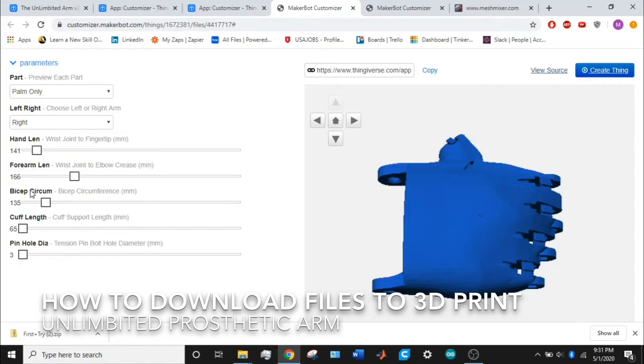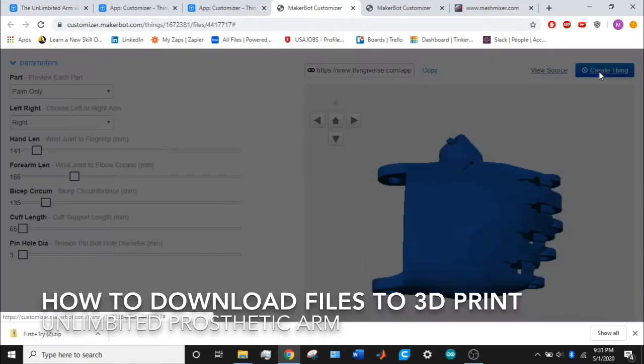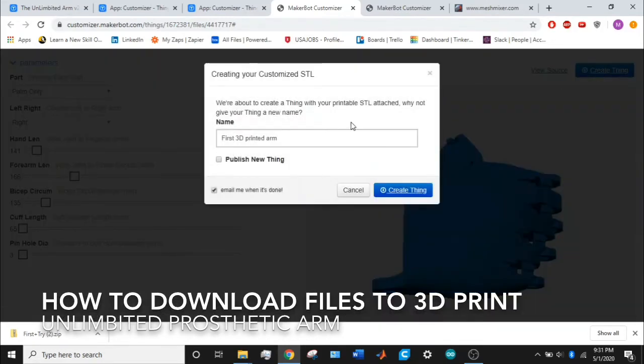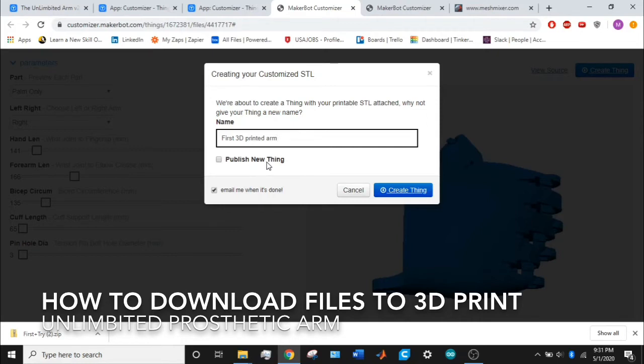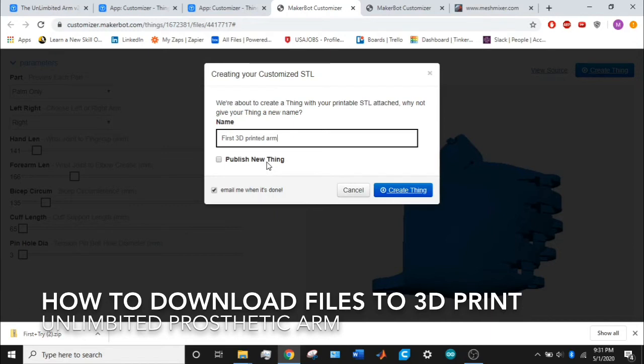Once you're done, go on create thing, type in a name—first 3D printed arm, that's just what I chose. This checkbox called publish new thing means if you check it here, your thing, this specific prosthetic arm length and dimensions, will be published and be available to the public for download and printing. Anyone will be able to see it and download it so they can print it themselves.